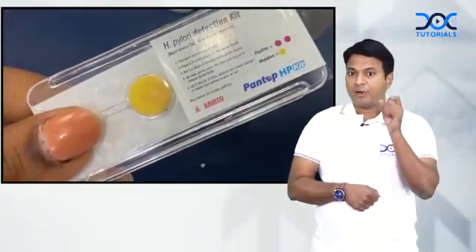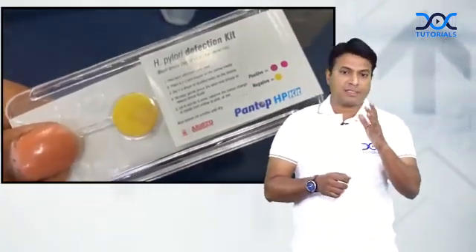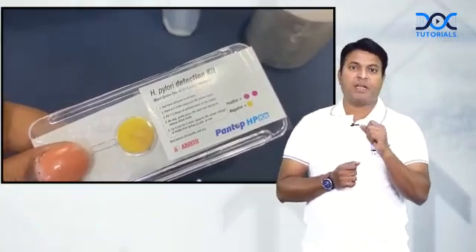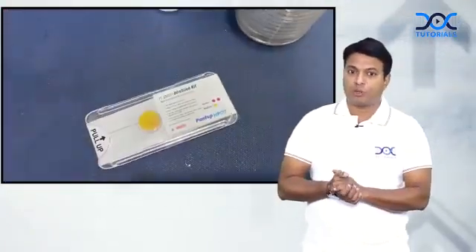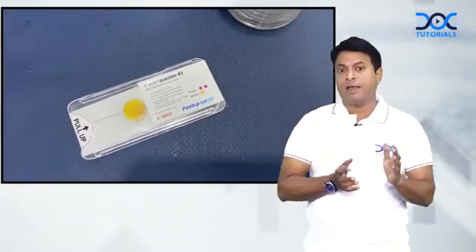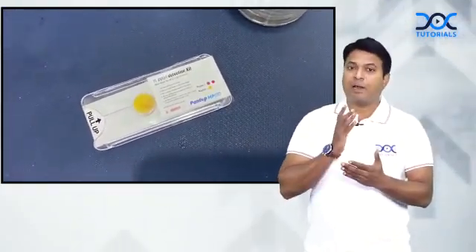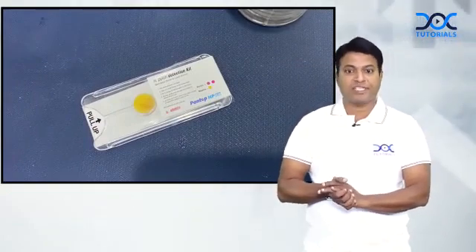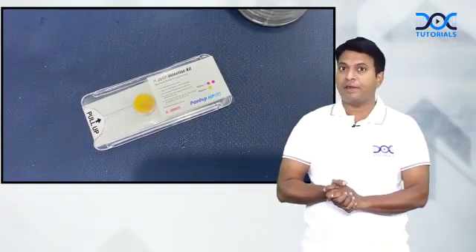After a few minutes, you can see the total slide becoming pink color. Before doing this investigation, we advise the patient not to take PPI for 7 days — this is a very important prerequisite. When the result is positive, we should give the H. pylori eradication kit for 14 days. You can see the color has started changing, and after a few minutes the entire slide has changed to pink color.